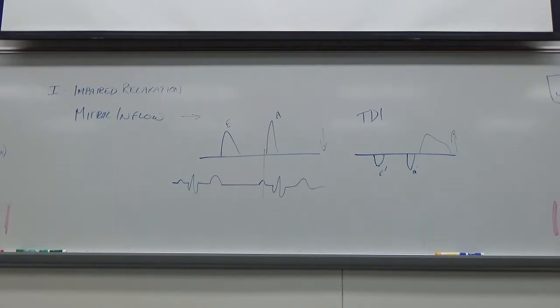So I've got my mitral inflow on normal: E taller than A. Valsalva just depresses it, but it's the same. Tissue Doppler, E is taller than A. My S and D waves are similar in height on the pulmonary vein inflow. My propagation velocity has a fairly steep angle on it. Those are the things visually that you're going to recognize as normal.